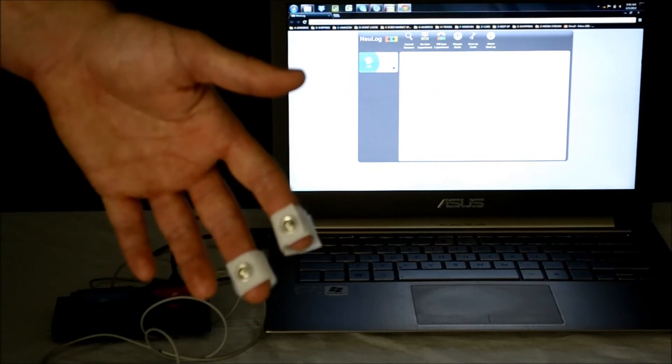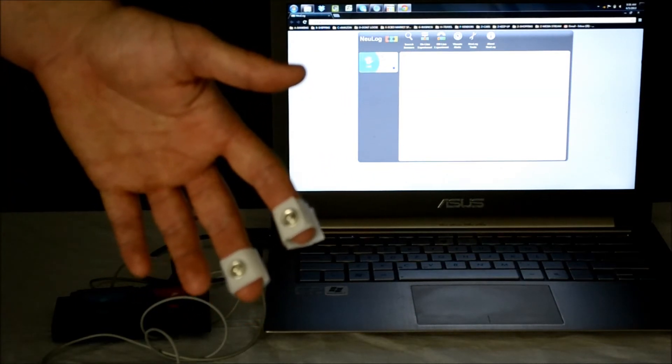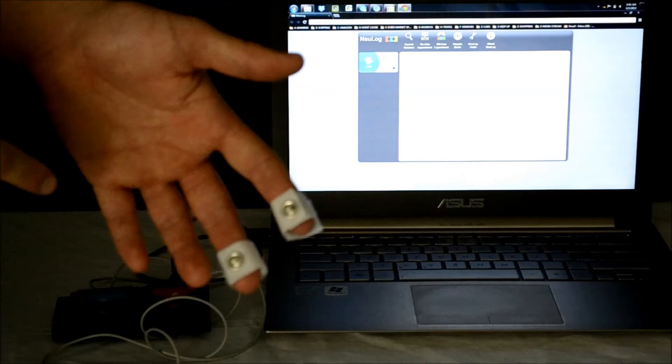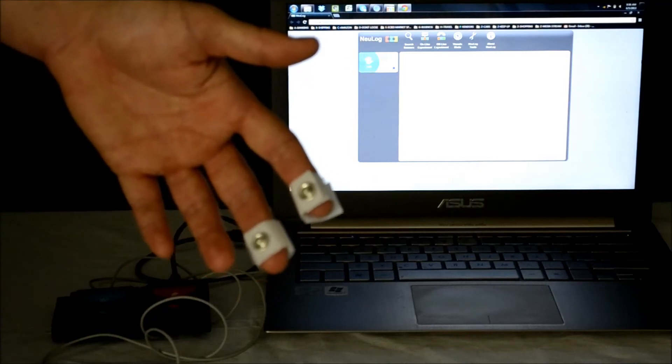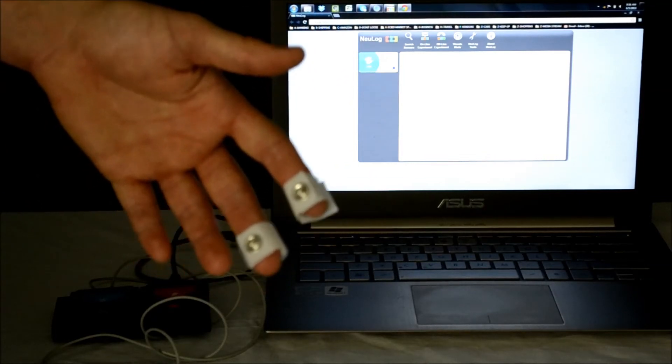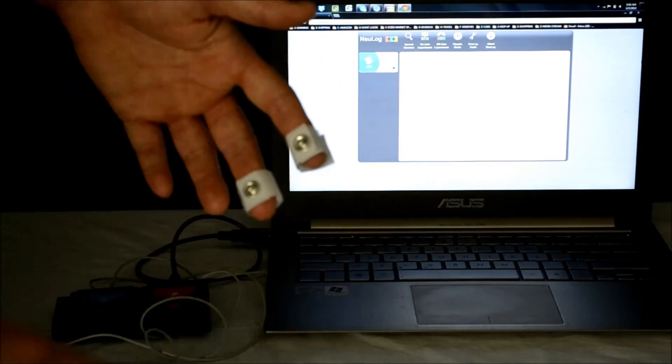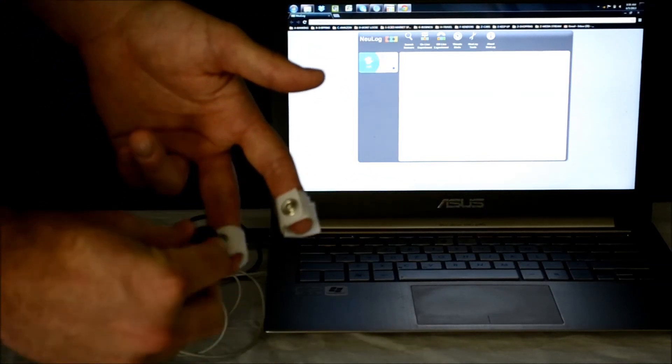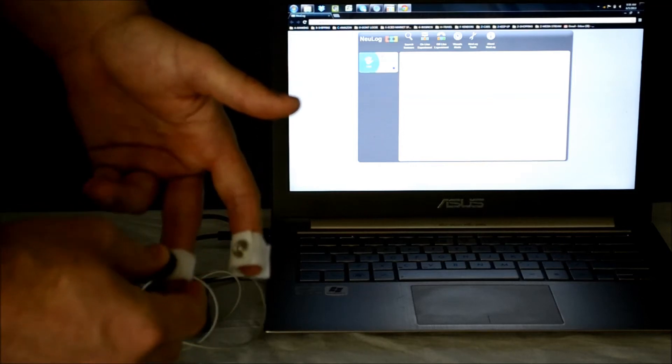To connect to the sensor, simply attach the straps to any two fingertips as I have done here so that the metal plate rests on the pads of your fingers. Lastly, just attach the connector cables.